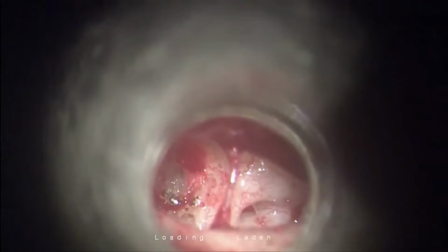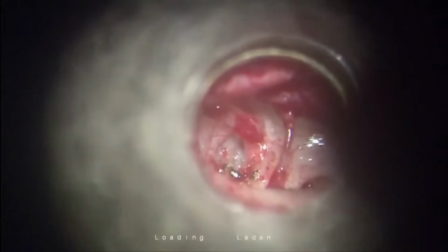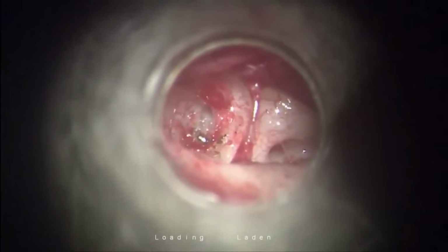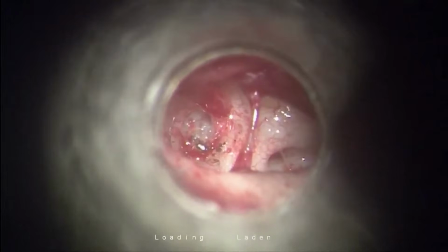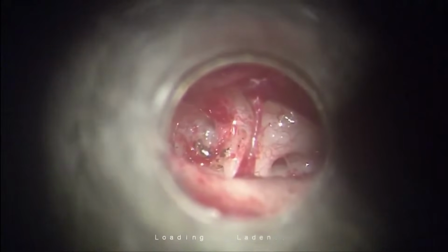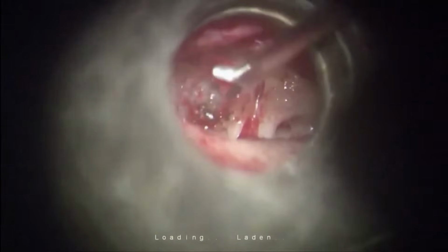At this point, I will measure the required size of the piston. Why have you not given me the proper circular, the diamond? Ashim, any comments? No, no, it's perfect. Very good. Are you ready? Yes, I'm ready. I'll be through in a couple of minutes. What I'm seeing is the required length of the piston. The piston I'm going to use is the Kurz piston, which I've used a couple of times. And the length I'm looking at, I'll start with 4.5 first.